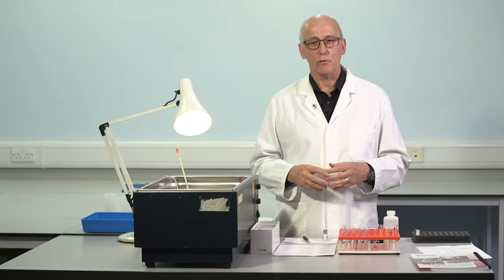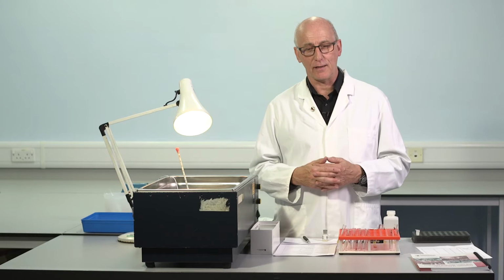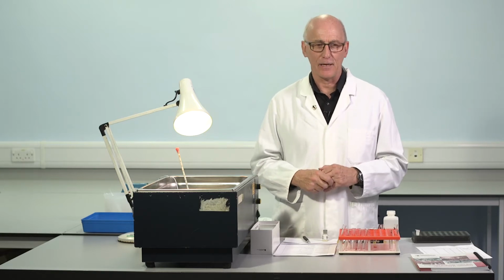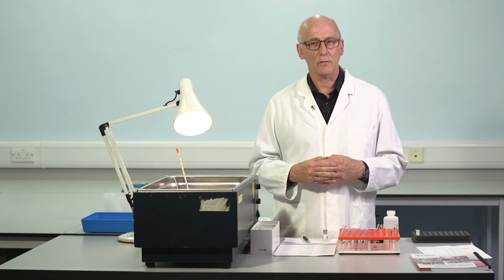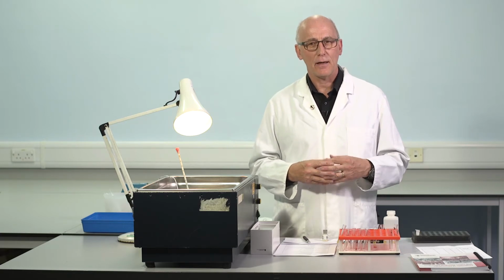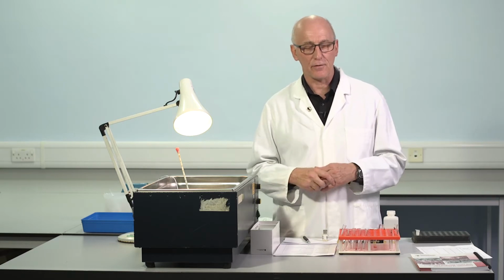There are some studies which have looked at the use of factor VIII deficient plasma even to construct those dilutions. Of course, that's got cost implications, and it may be particularly useful to do so if we're performing assays where the factor VIII level is particularly low. There is some evidence for that.